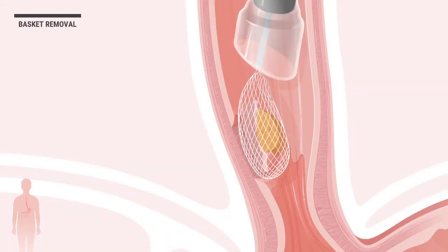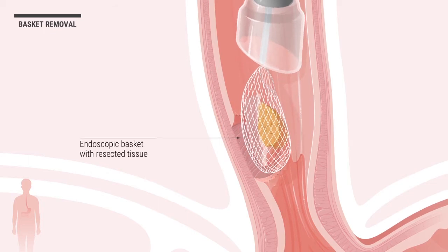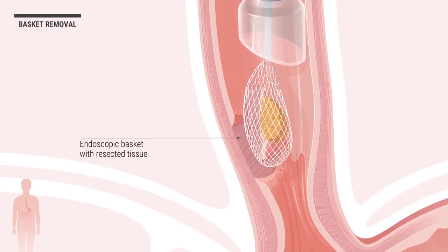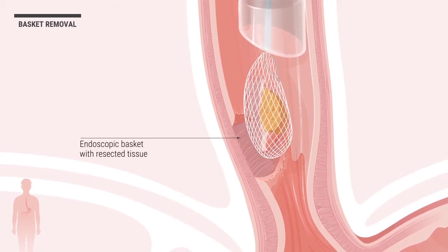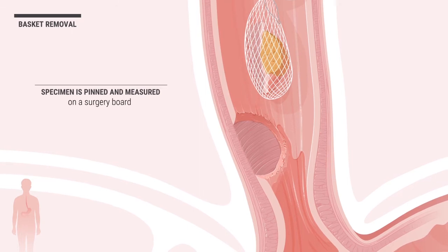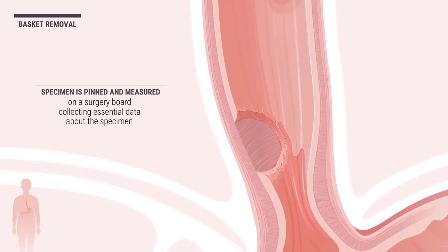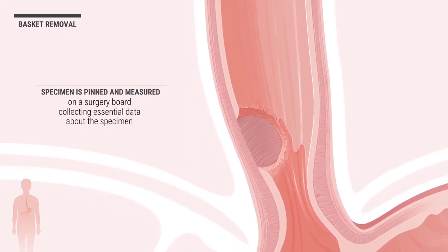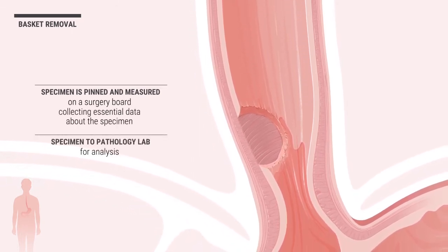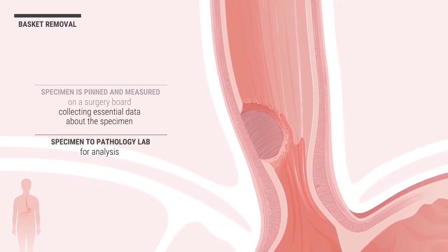Now, the resected tissue is removed with an endoscopic basket, after which the specimen is pinned and measured on a surgery board, collecting essential data about the specimen and sending it to the pathology lab for analysis.